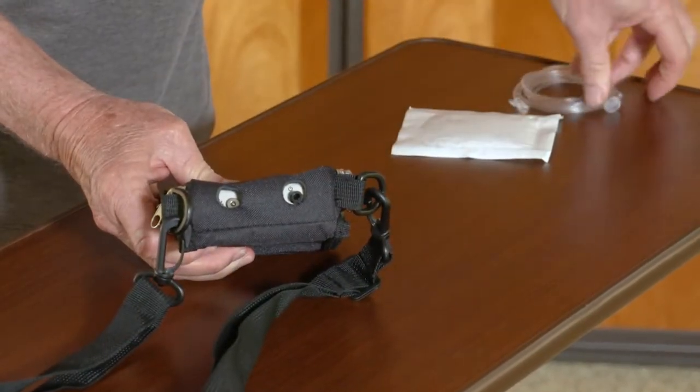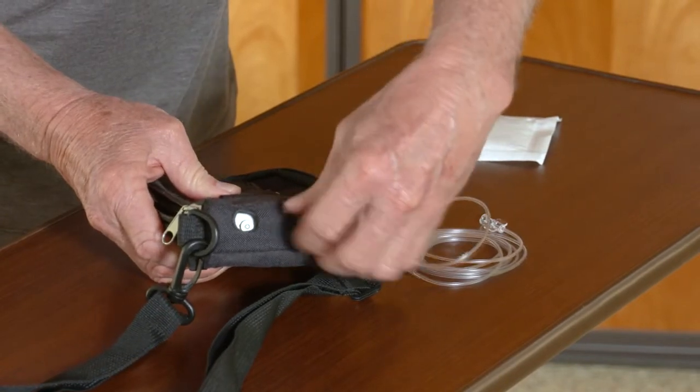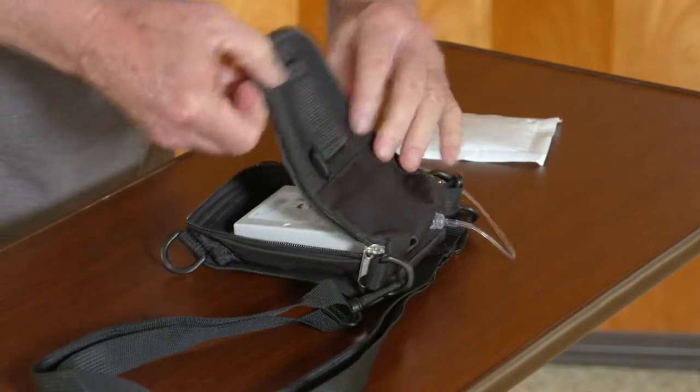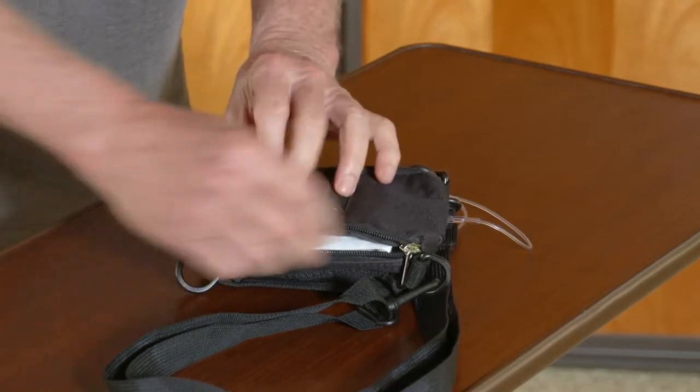Align the oxygen charging ports with the holes on the top of the case. Connect the male lower end of the extension set tubing to the female port by inserting and turning clockwise until secure. Place the Humidikant pack on the back of the device and zip close.